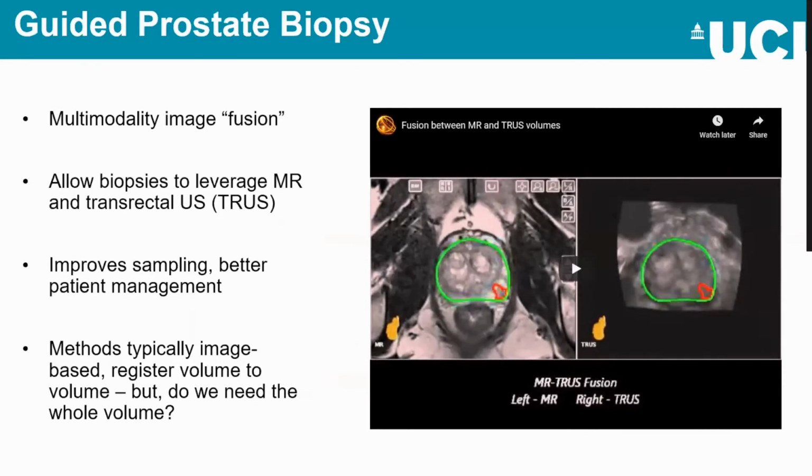So when we look at ways of trying to improve prostate biopsy, we can look at multimodality image registration of ultrasound, which is already used to guide the biopsies typically, and those preoperative MRIs, and do something that the clinicians will call image fusion, but that most of the people here would refer to as image registration, as was in the title. And so one use of this image fusion is for doing this kind of magnetic resonance and transrectal ultrasound registration in real time in the surgery.